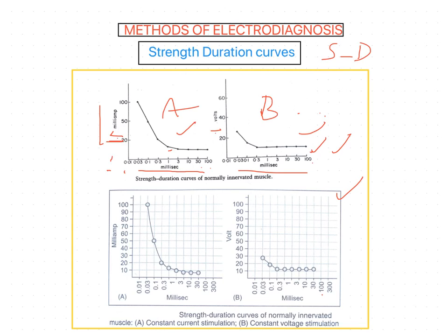This may be assessed visually or by palpation of the tendon, depending on the muscle being tested. The magnitude of current is noted and the impulse is shortened. This procedure is repeated for each length of stimulus in turn, the magnitude of current being increased as required.